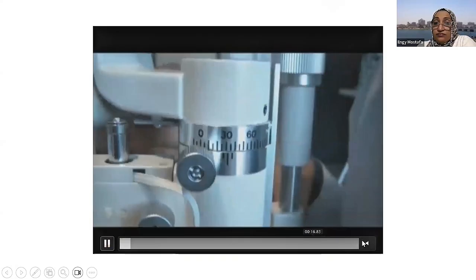So we go inside, and if we are here, this is the anterior capsule, and this is the epithelium, and here is the lens. This is the cortical lens. And then by more focusing, we can get to the nucleus, and this is the back of the lens as well.